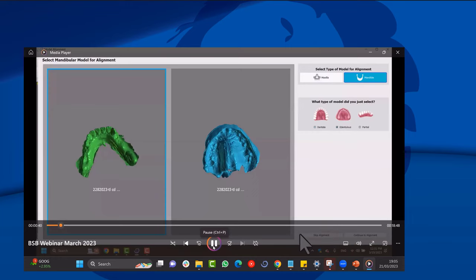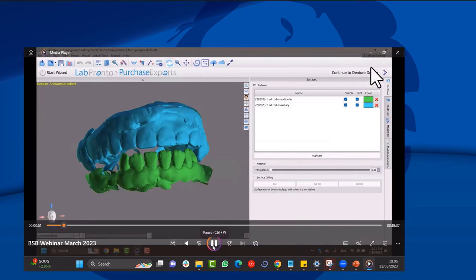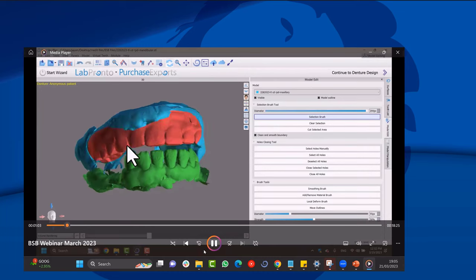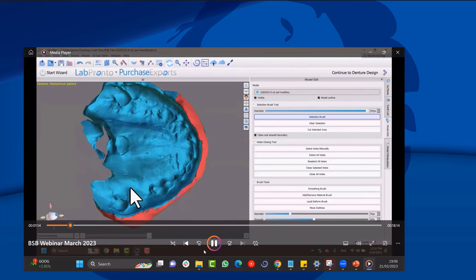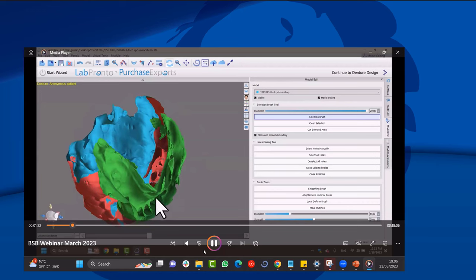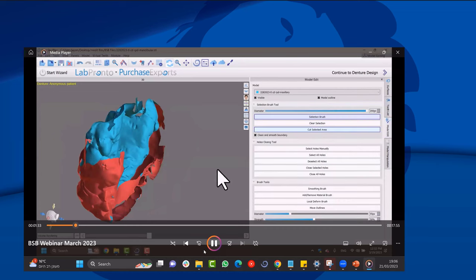First we import the models: a scan of the upper denture impression and the lower partial and lower models. We align the mandible first, since that's the actual model — I use edentulous because posterior teeth are missing. Then I use model edit with the select brush — hold shift and left mouse button — to select and remove everything that's not the impression. Use Ctrl+Z to undo any mistakes.